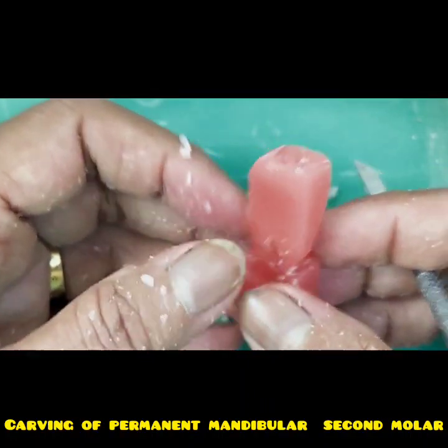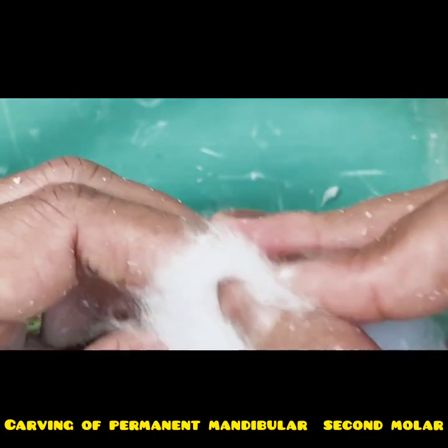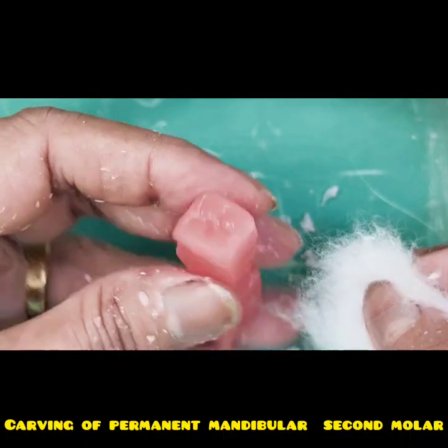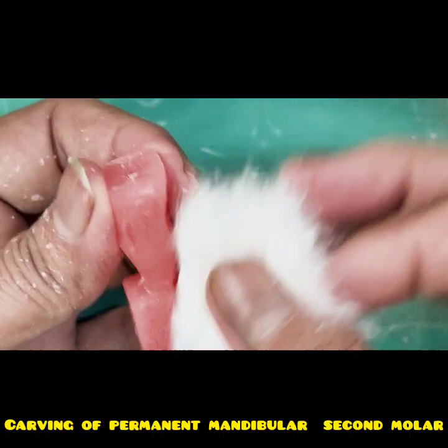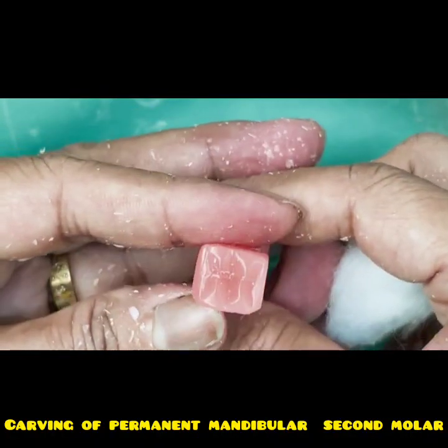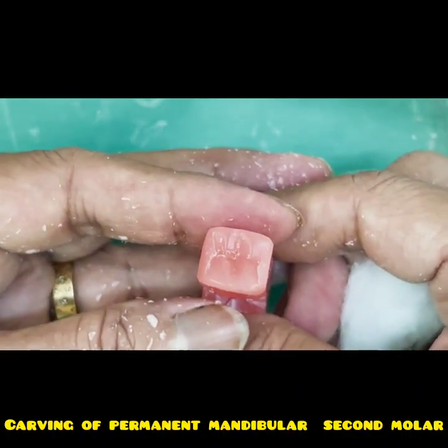So I will not go into much detail. Let's polish and see. So this is how it is done. Little bit of polishing. So this is our mandibular second molar carving, 2 buccal cusps and 2 lingual cusps. Thank you.